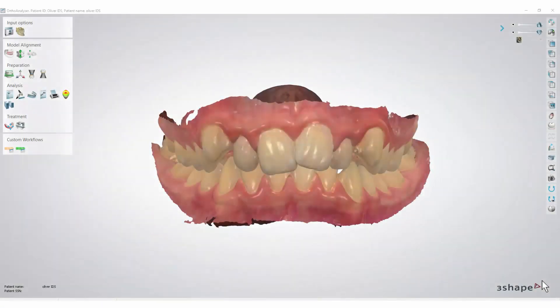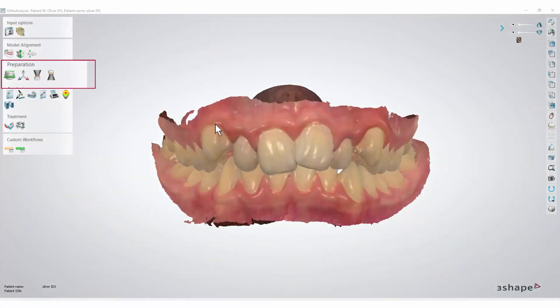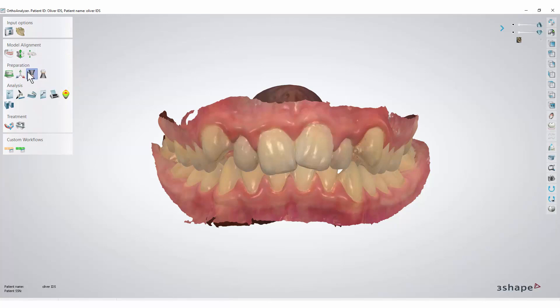To start the segmentation process, go to the left toolbar and press the Segmentation of Maxillary Model button in the Preparation section.